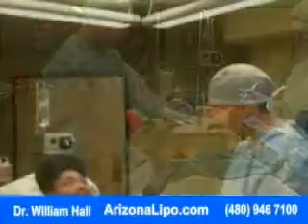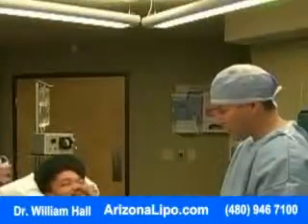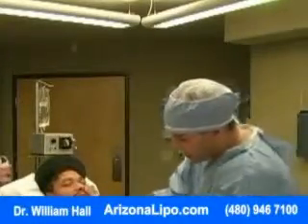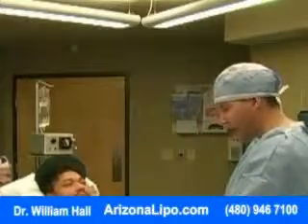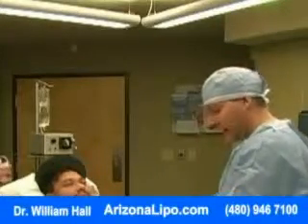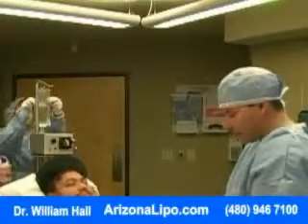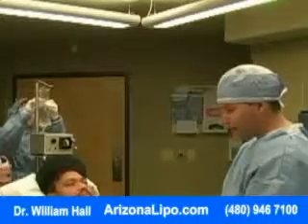How do you feel? Feel good. Good. So it took a while to take that out, but you did really well. Thank you. And we just have the little incision sites. We got about 5 of them on the front, about 2 or 3 on each side. But a lot of this stuff you see in here right now is, of course there's a little bit of fat left there, but mostly fluid and kind of the inflammation. So you'll stay inflamed and swollen like that for the next few days, and then it's just going to slowly get better and better.